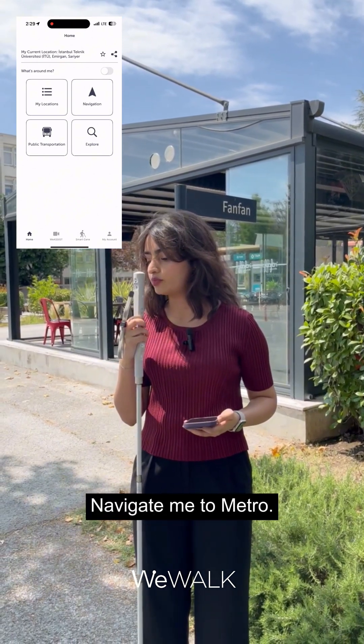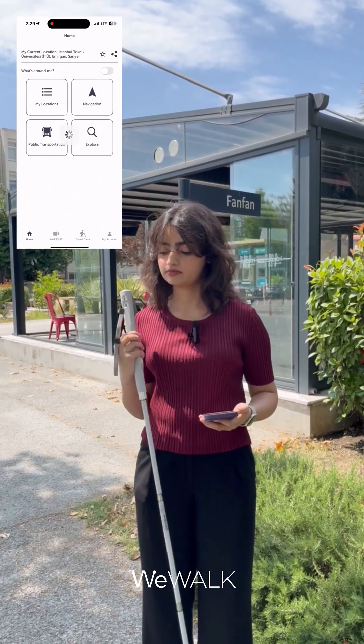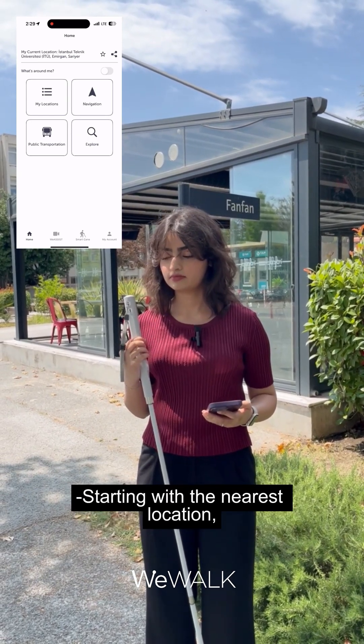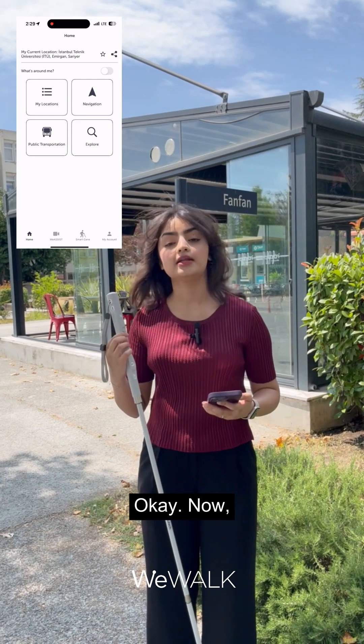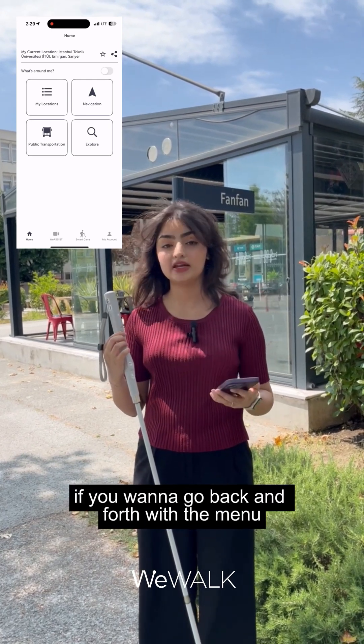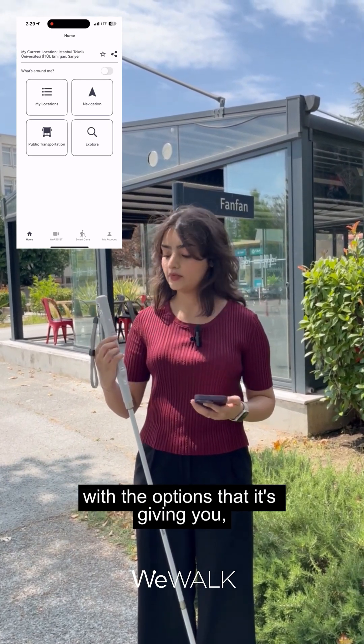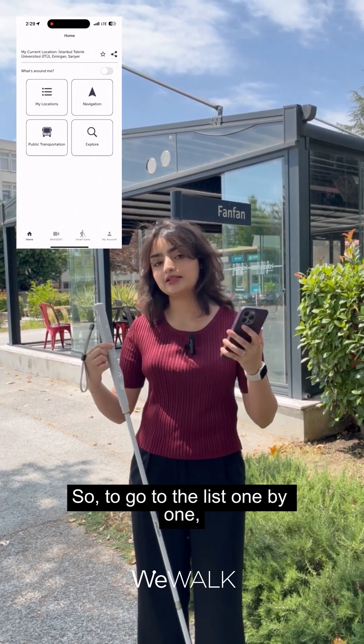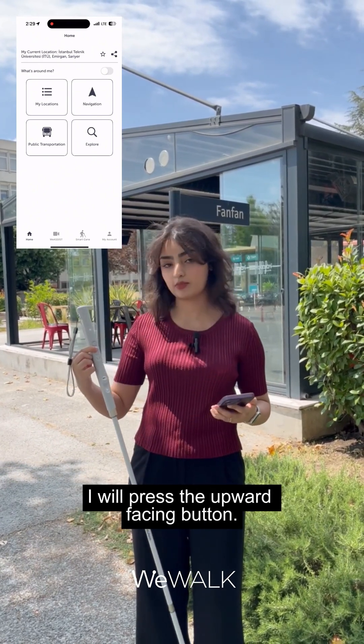I say 'Navigate me to Metro' and it responds: 'I found five addresses — I will sort them based on distance, starting with the nearest location.' To go back and forth through the options it gives you, you can use the upward and downward facing arrow buttons. To go through the list one by one, I will press the upward facing button.